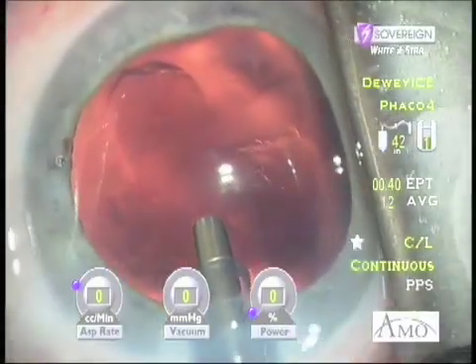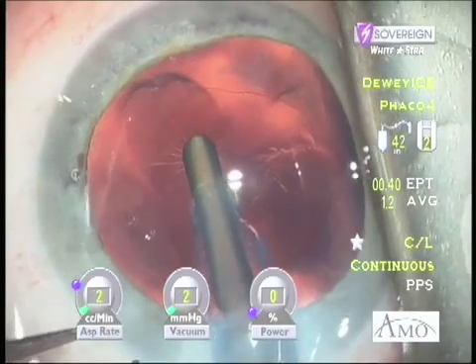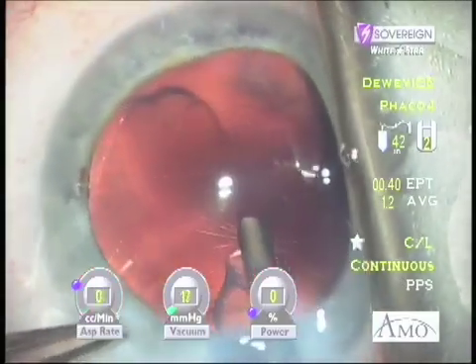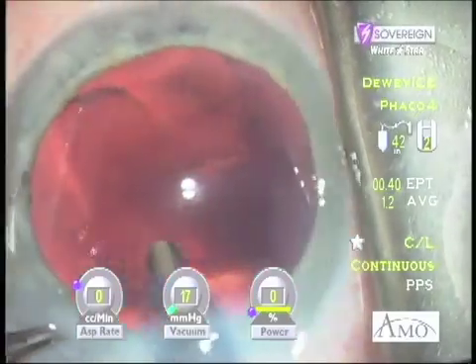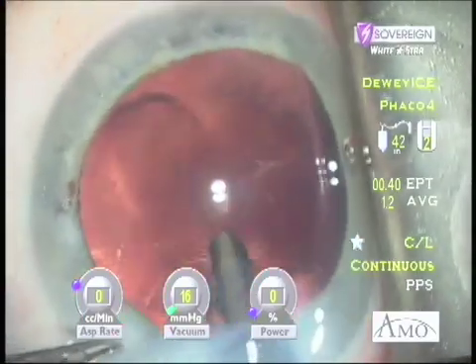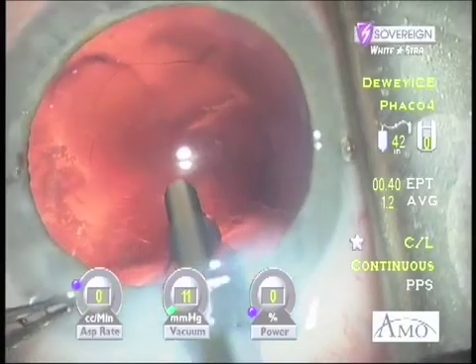While the thrust of this video has been about the use of ultrasound to assist in the polishing, the Radius Tip can also be used as a vacuuming device without ultrasound. In this example, the cortical fibers adherent to the capsule were more visible to my eye than the camera. As the needle is gently applied across the capsule using vacuum to achieve stability, the debris accumulates and, very fleetingly, can be seen in the red reflex just to the left of the FACO needle.